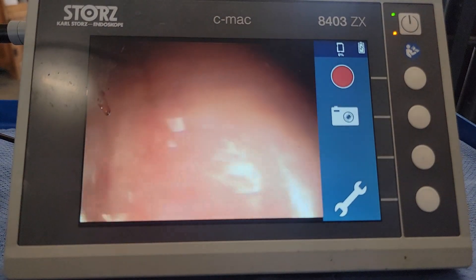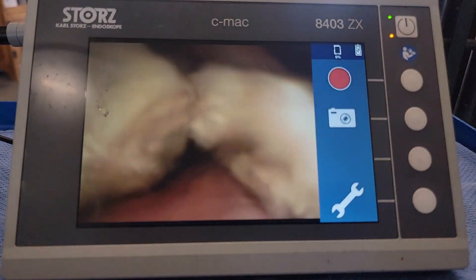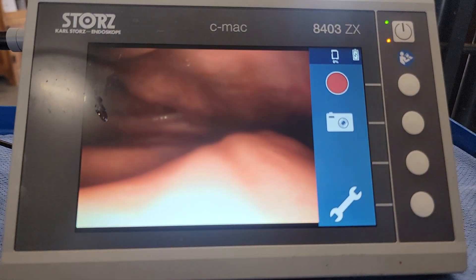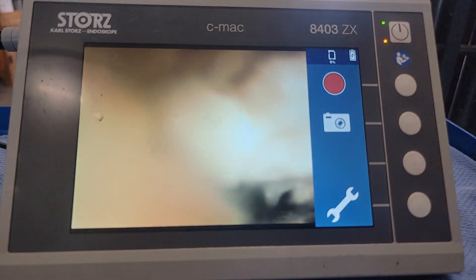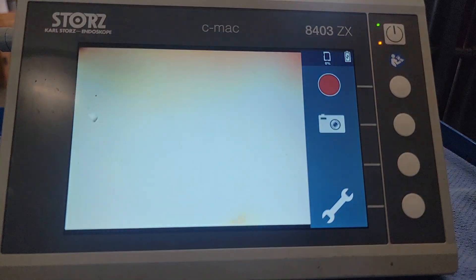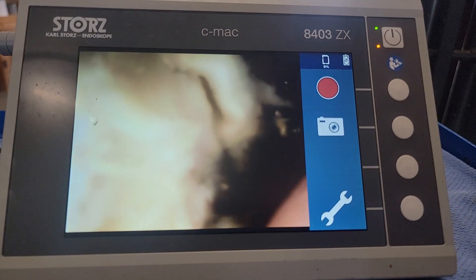We're going in and flushing it out through the endoscope. Here you can see we're trying to lavage out these big chunks of pus. We came out of the sinuses because the horse moved its head, but that's okay — we're taking these chunks out of the nasal passage. You can see how we're blasting this area and trying to dislodge all of this pus.